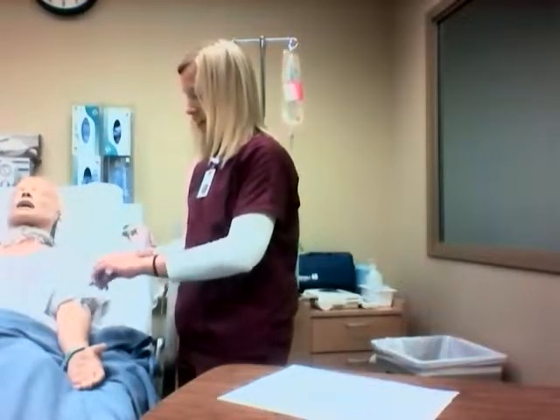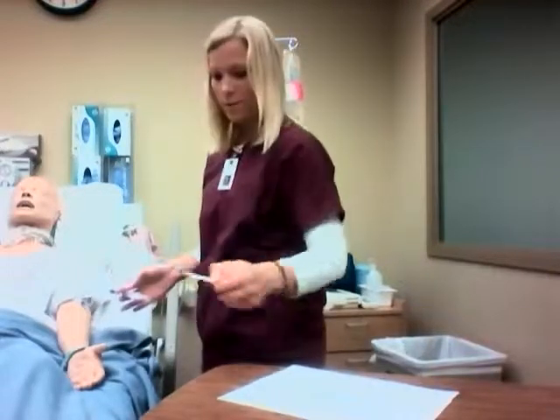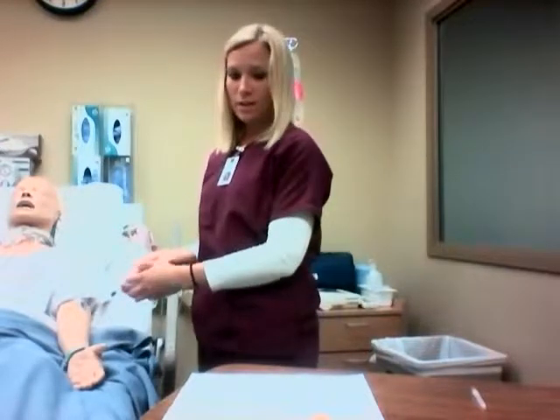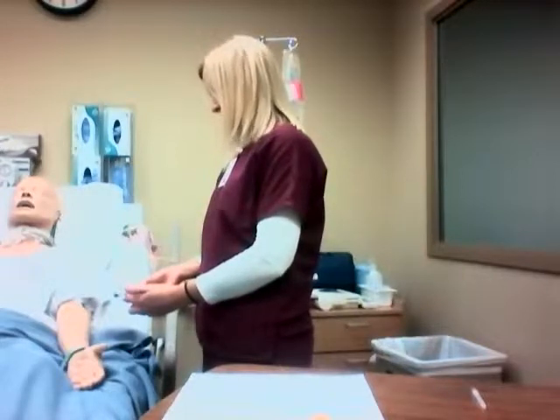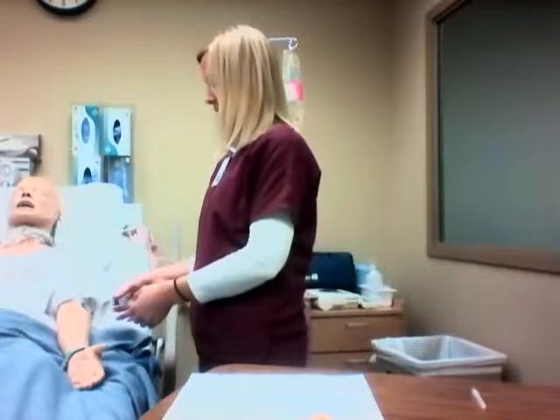Without contaminating, I'm going to connect it to the Y port. And then this medication I'm going to administer 2.5 mils per minute for 2 minutes. So I would go ahead and infuse that. And after those 2 minutes, I would go ahead and disconnect it.